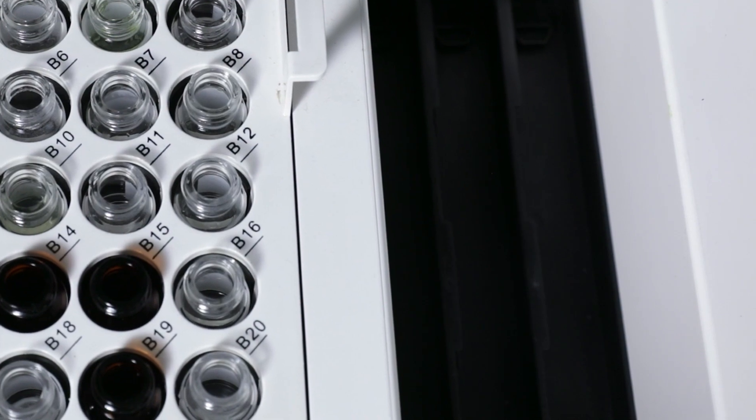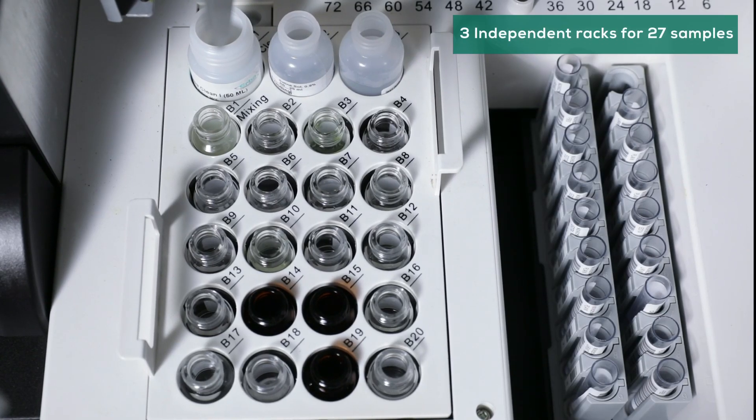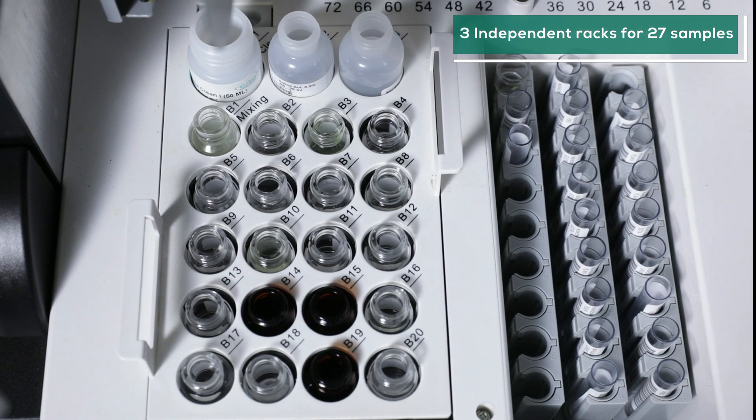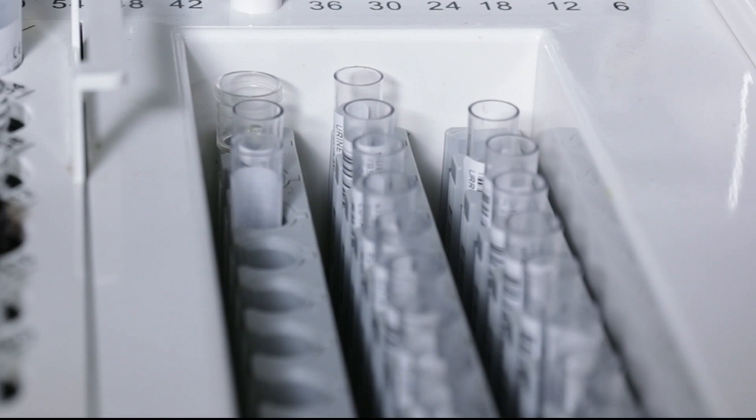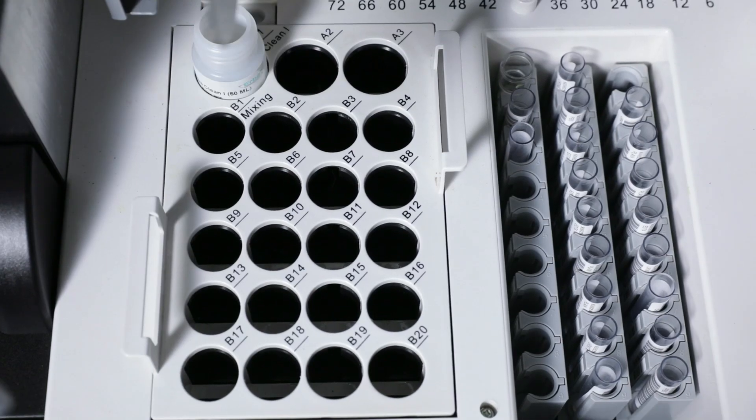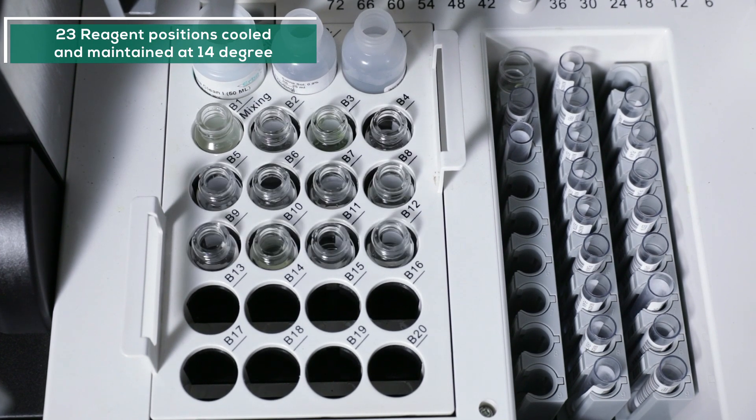With continuous loading capability, ECL760 comes with three independent racks for 27 samples. Sample tubes are barcoded for positive identification. Cooled and maintained at 14 degrees, 23 reagent positions are provided with a stirring facility.